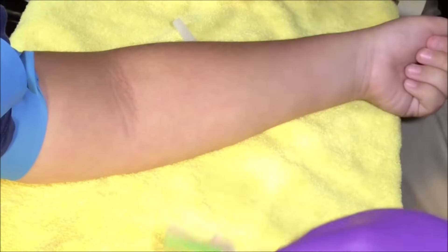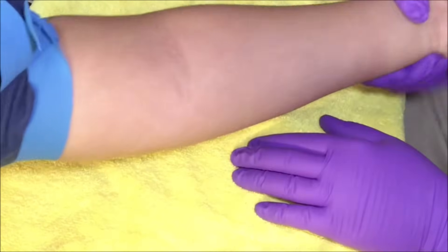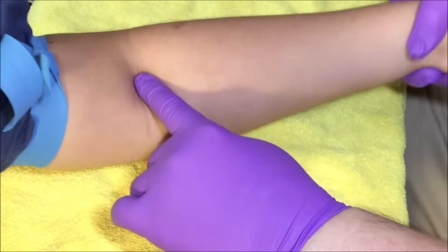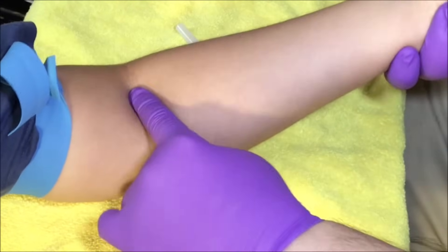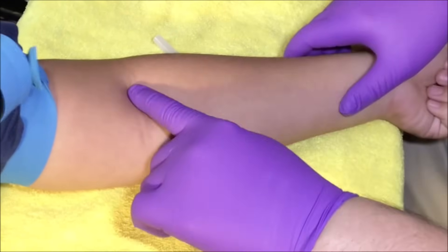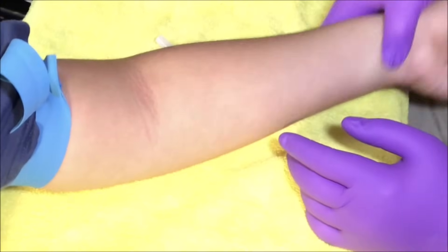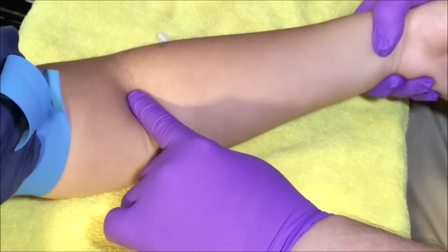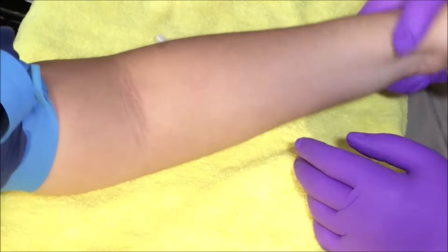When you're ready to draw the blood, you want to go right into that center circle where you located the vein. Make sure you bend the elbow a little bit, or you can twist and bend and push as you're locating the vein — that makes a big difference. Most people just like to push, but if you actually start to bend the elbow a little bit or turn as you're bending, you can feel the vein much more easily.